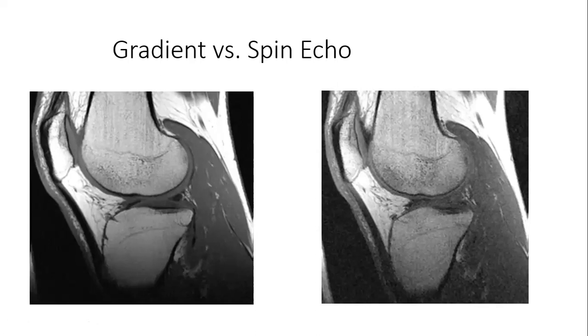Sir, yes, I can hear you. I don't know which one is the first, but on the screen, maybe the one to the left. Okay, to the left. Right, the one to the right is a gradient echo. Okay, that's excellent. You shouldn't give us any problem. You can see the gradient echo versus spin echo.